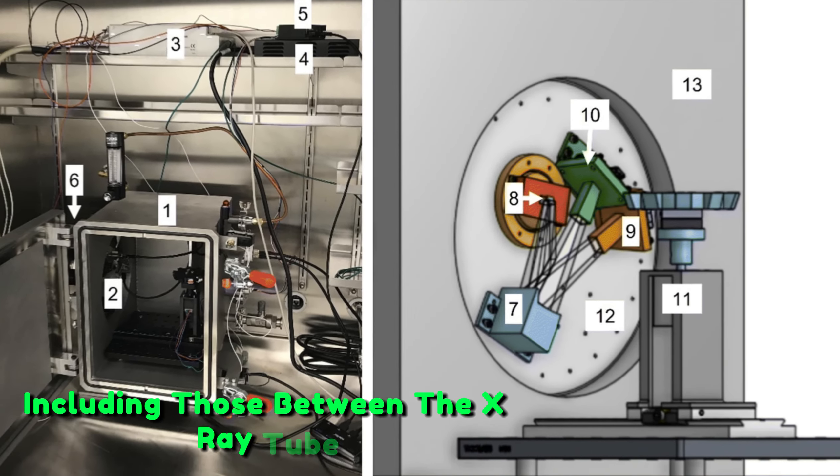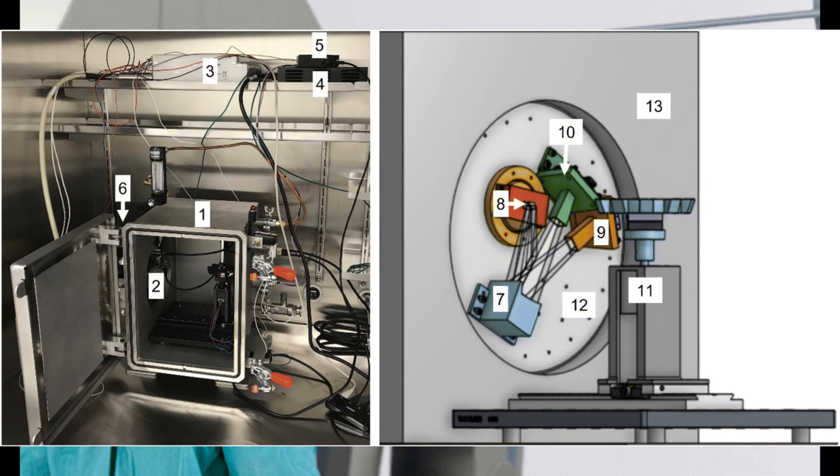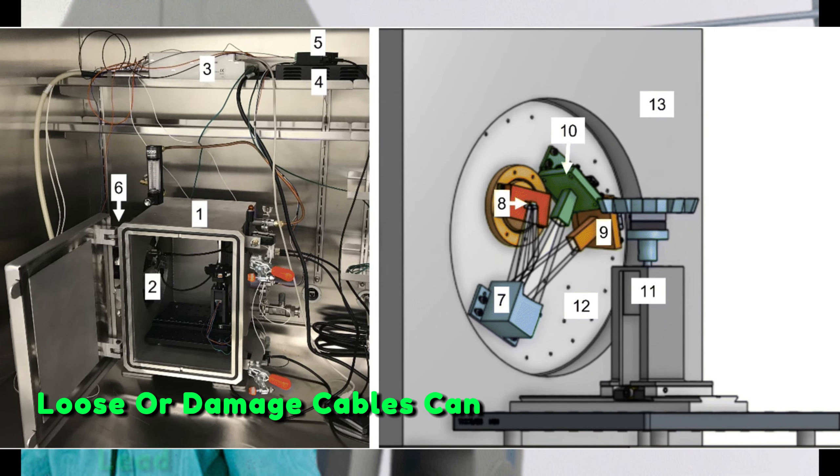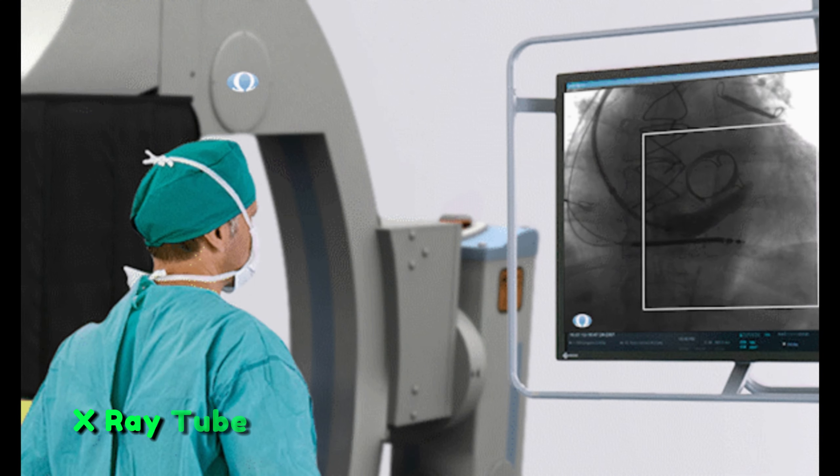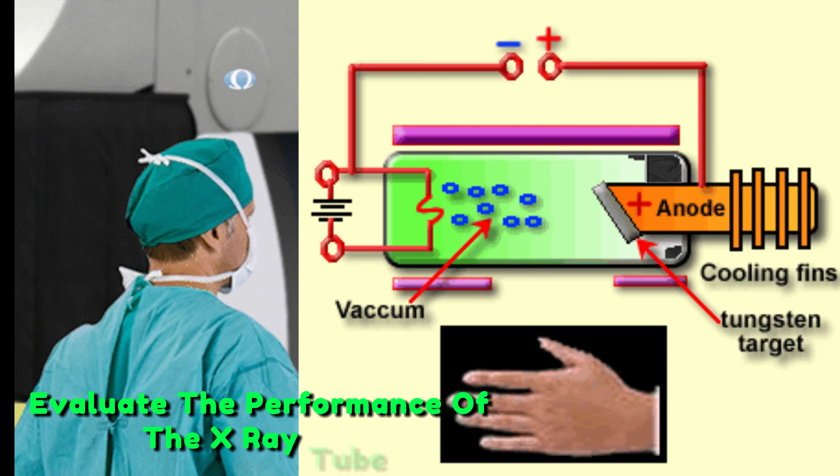Cabling and connections. Inspect all cables and connections, including those between the x-ray tube, control panel, and image receptor. Loose or damaged cables can lead to malfunctions and image artifacts.